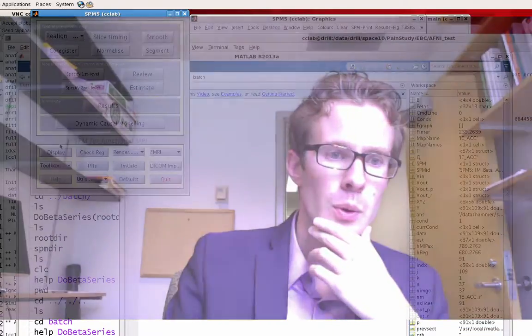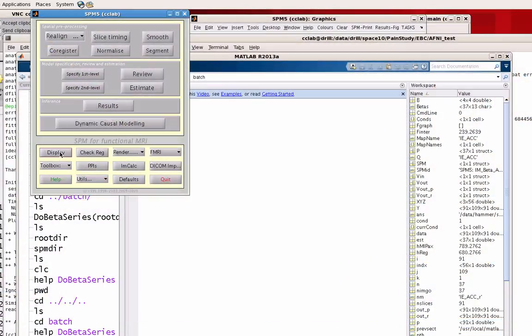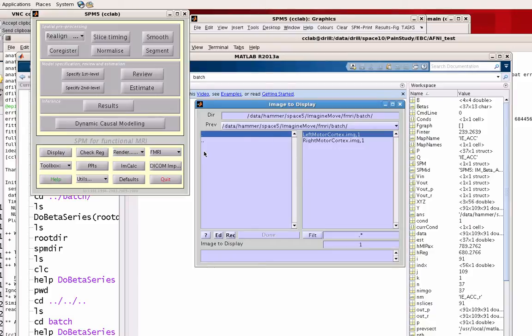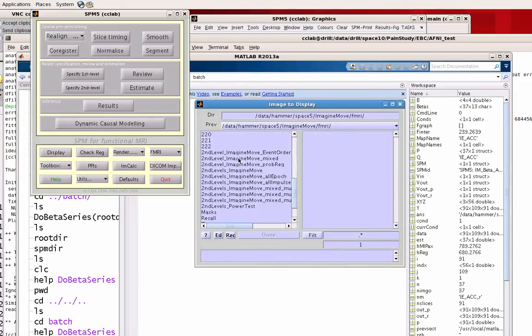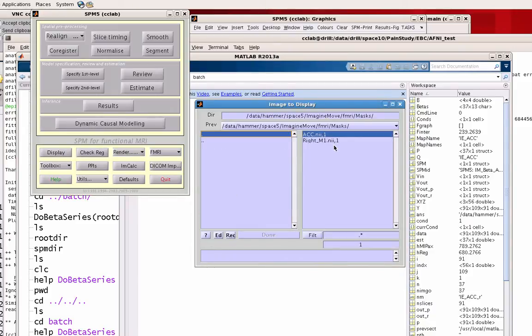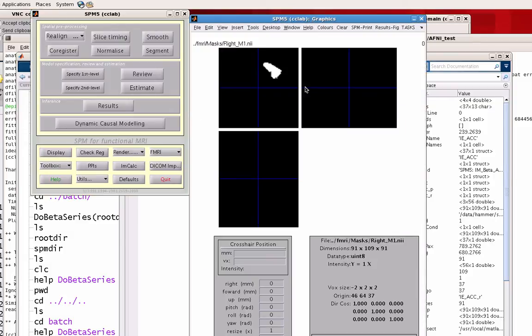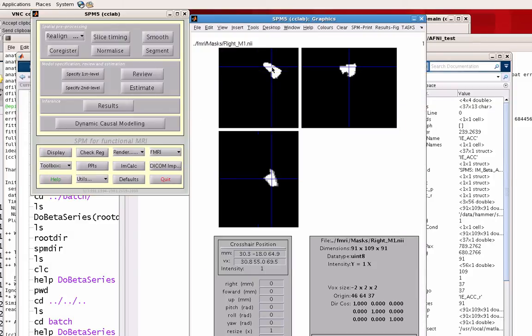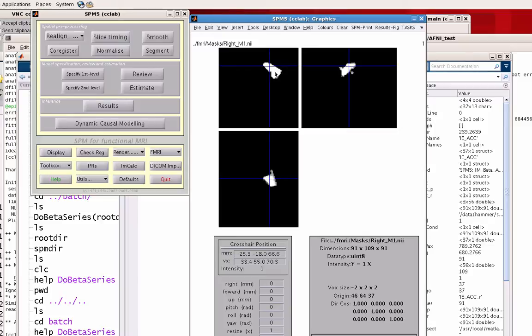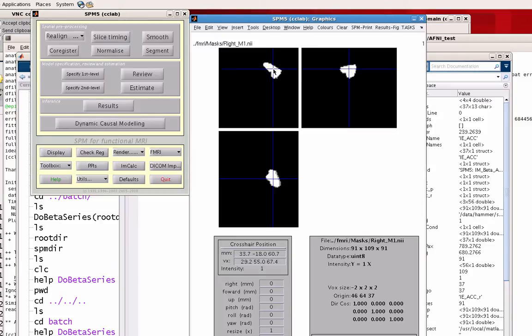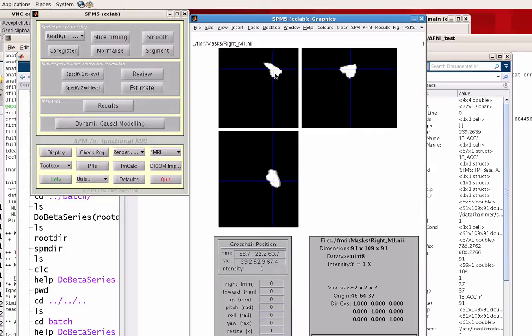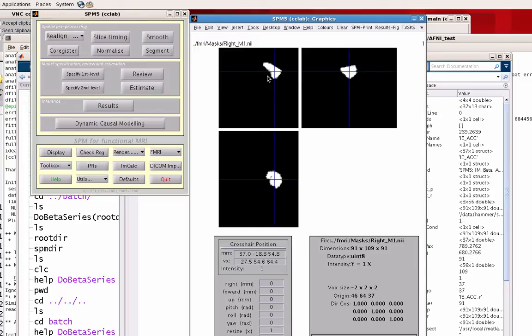So first let me show you this mask that I created, this ROI that I'm looking in. Let's say we're looking in the right M1. This is something I created. It was actually a functional contrast, left minus right, from the same GLM before I broke it apart into a beta series analysis. So if we overlay this on a template brain, you would see this is pretty much most of the right motor cortex. So this is where we're going to be looking for the betas, the beta series, and then correlating that with the rest of the brain.